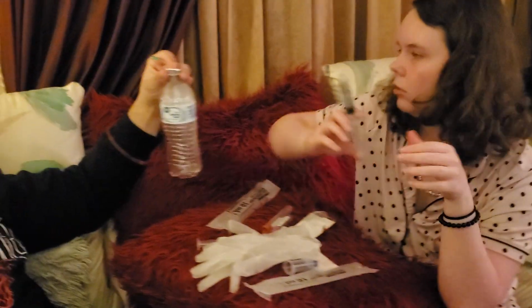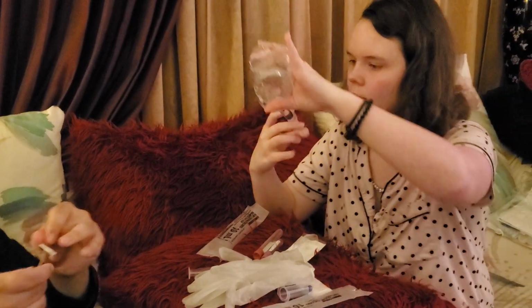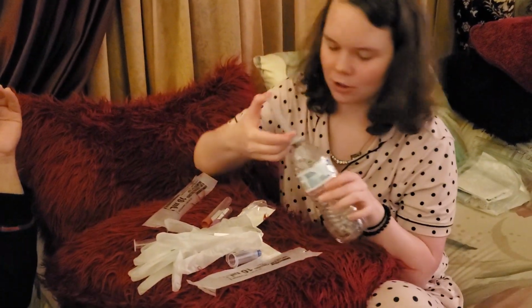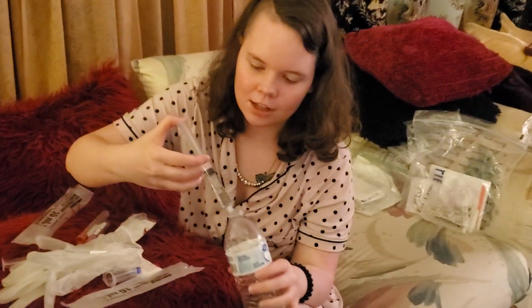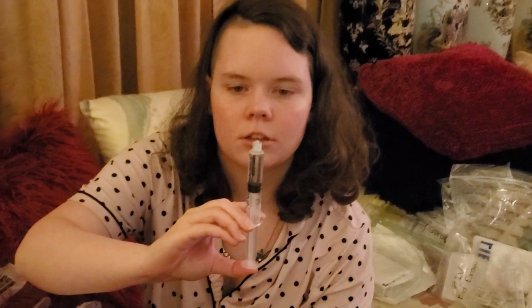So it worked, huh? The bottle. Yeah. It really worked. Very good. Very nice, Bree. I forgot that there was water in that. Ah, dang it. I can't squirt the air because I want to squirt. It should be fine if I do this, right? You are so well informed.